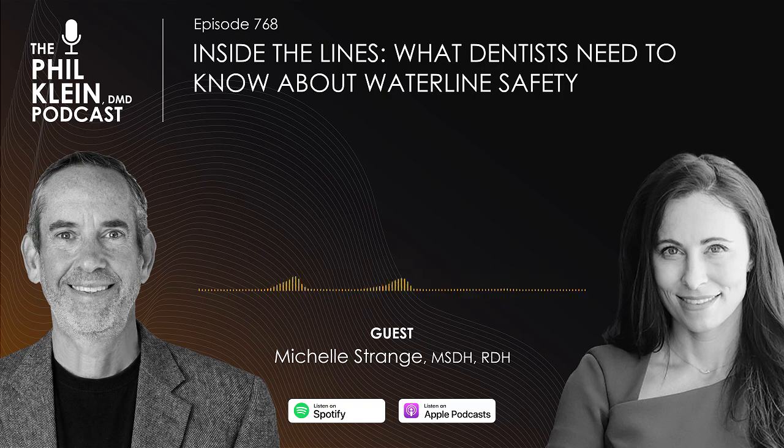But yeah, I do believe that there are a lot of misguided people who, because they think that they're putting this tablet in there or whatever, that they're safe and they're keeping their patients safe. But you genuinely have no idea unless you are testing. Yeah, and they believe they're using distilled water and that's okay. And that's a whole other beast of a problem.